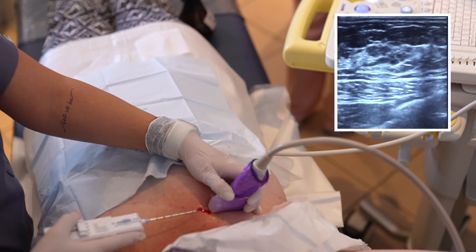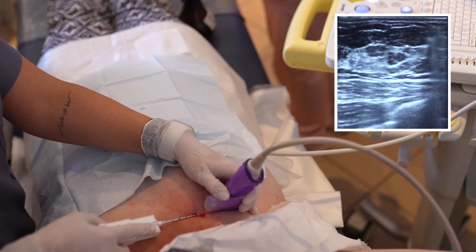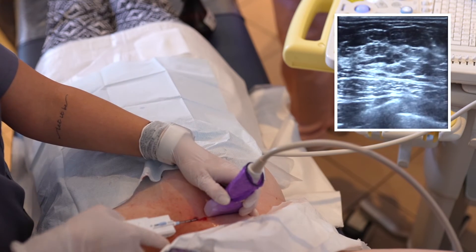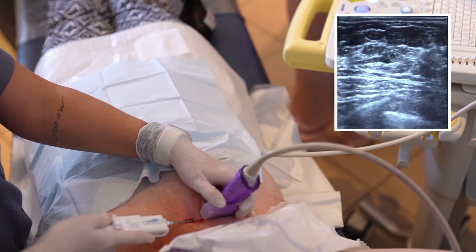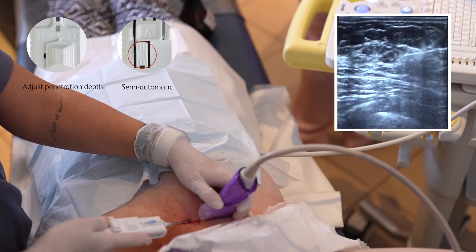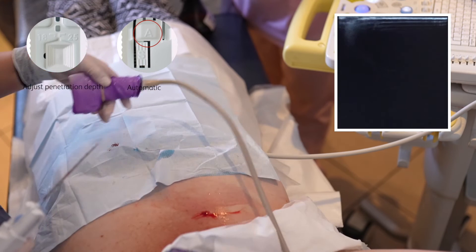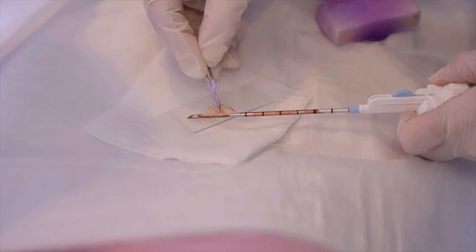Another sample is taken without the coaxial for demonstration purposes. Due to the echogenic tip, it is very clear to position and view under ultrasound. As you will note, the samples are not fragmented and are of great quality, which in turn gives excellent and accurate pathology results.